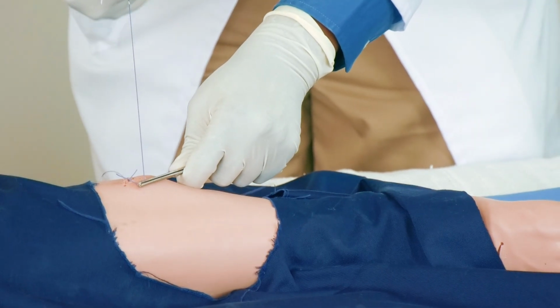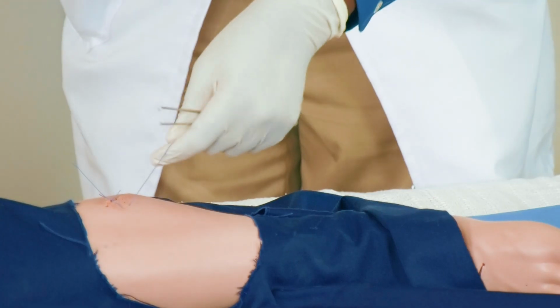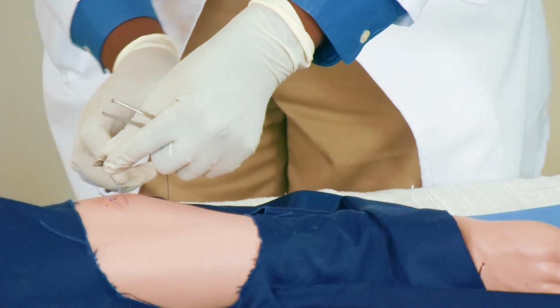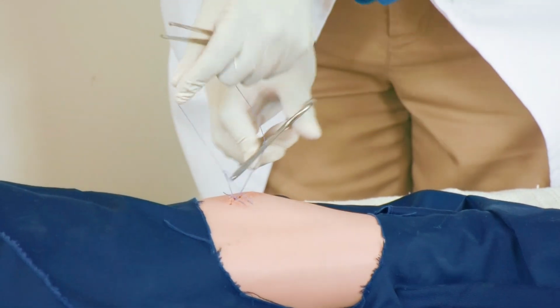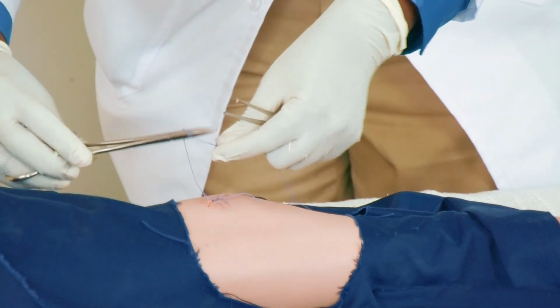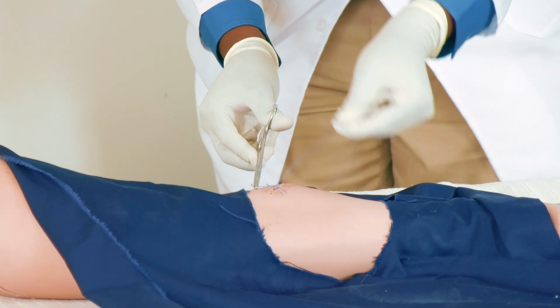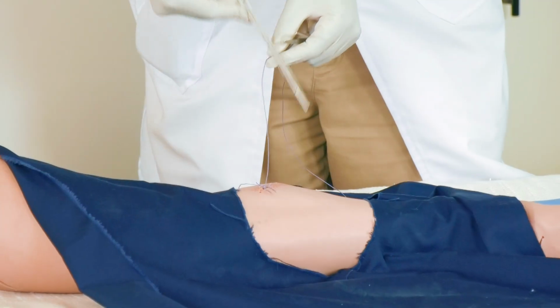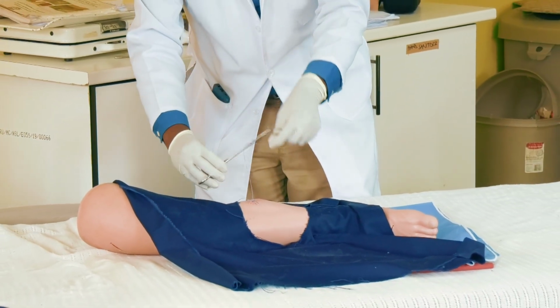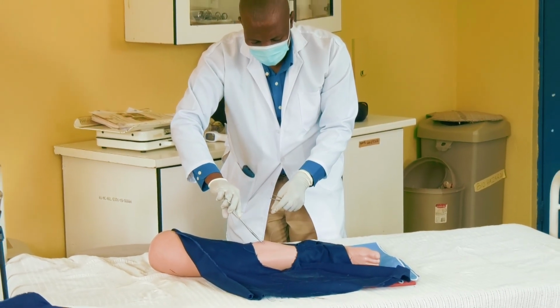Remember, the patient is not feeling any pain. Pull all the way like that. 1, 2. Hold that. Tight. Again, 1. Pick. So you should try it when you are doing your return demonstration. Do it like that. Then try to tie it. It will not hold. So I'm saying this should face up. Okay? Then pick this.